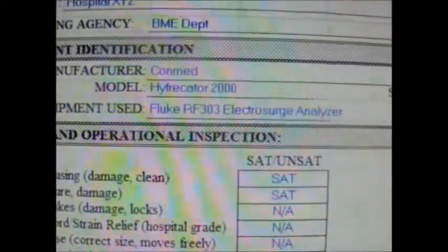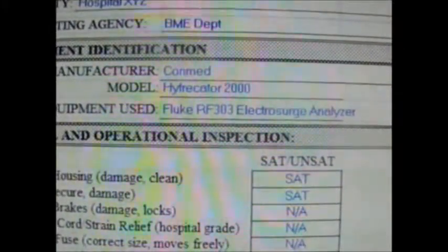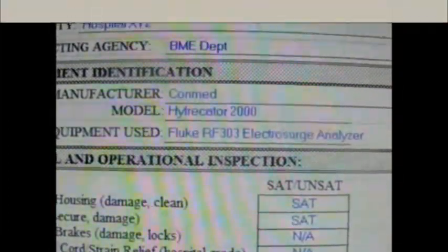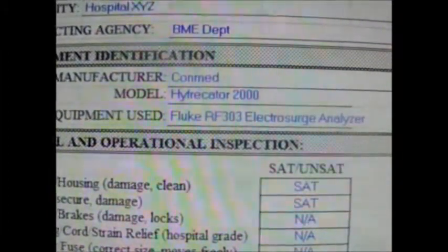This is the Conmed Electrosurge Calibration Verification, or PCI, form. The top half is the Equipment Identification section, including the Hospital XYZ Facility Name and the Inspecting Agency, which is the Biomedical Department.